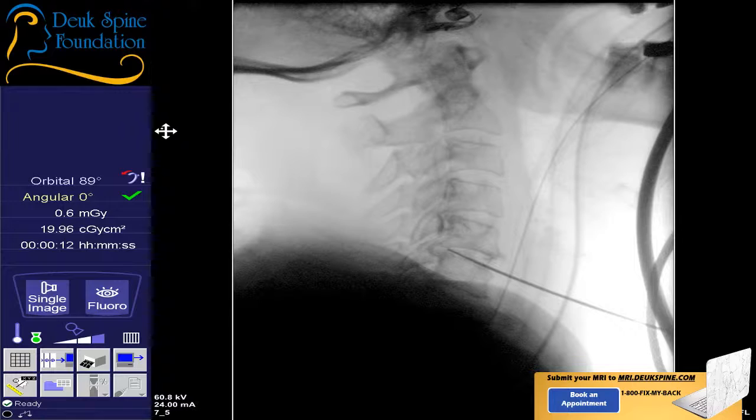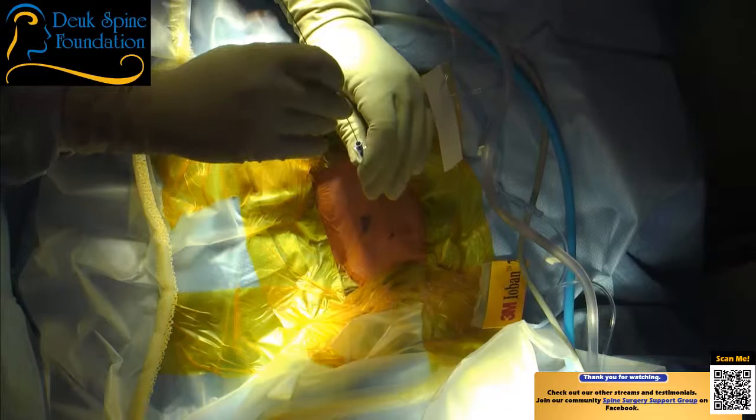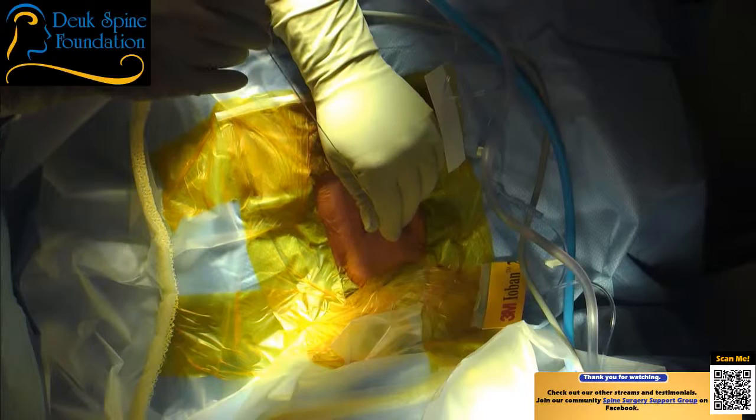I feel very confident about the level. I'm counting from C2 down. We want to make sure we can clearly visualize. Let's just keep blood pressure below 110 systolic, please. So now the guide wire's in, I'm taking the needle out.